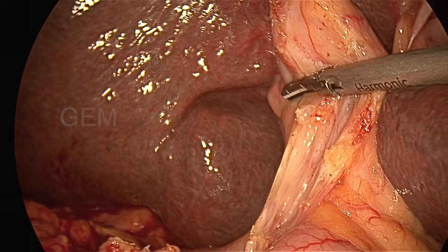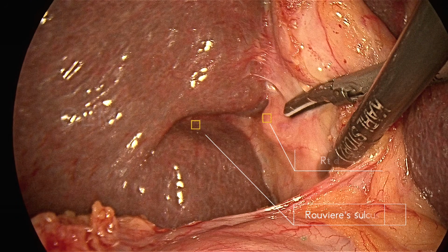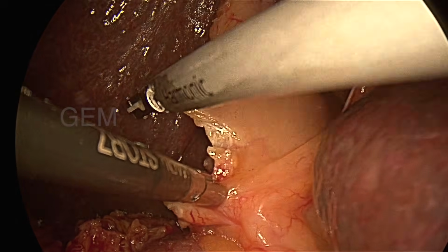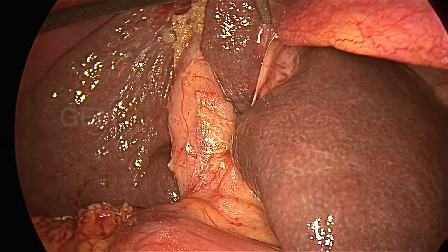So that is the Rouviere's sulcus. Once you see the sulcus, the infundibulum will be there, the infundibulocystic junction, and you can see the right hepatic duct, the right duct, and the Rouviere's sulcus. At that level, I have to stop. Otherwise, if you go down, I may injure the CBD. So I started doing it laterally.